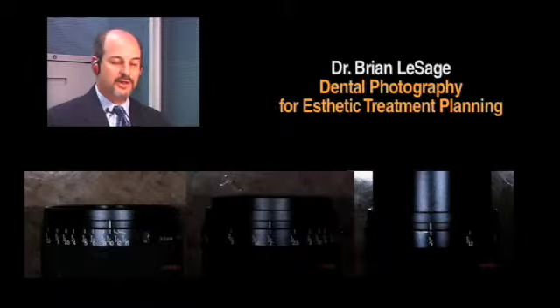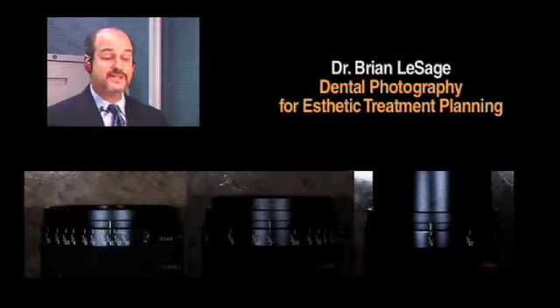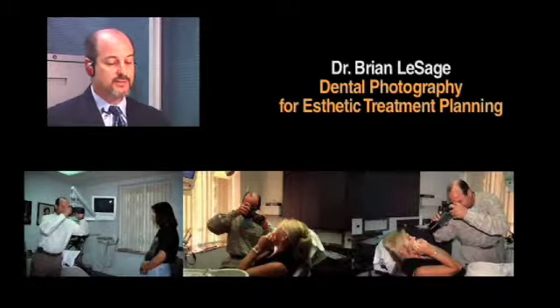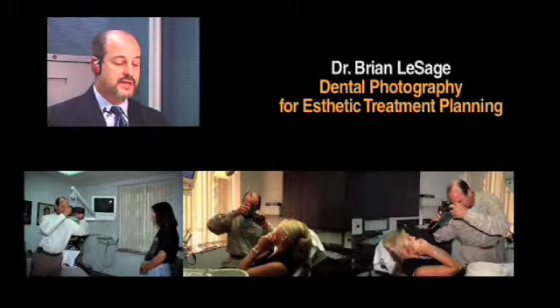Don't scratch it really heavily, but just put a small mark so that when you're taking a full face picture of the next patient, you can just spin it to that very lightly scribed mark on your lens, and then you know you're at a 1:10 view, and it's consistent. So all your 1:10s, all your pre-ops or post-ops, all your full face views will look very, very similar. All right? And so here's the key: when you're doing a full face view, 1:10, we're this far away from the patient.